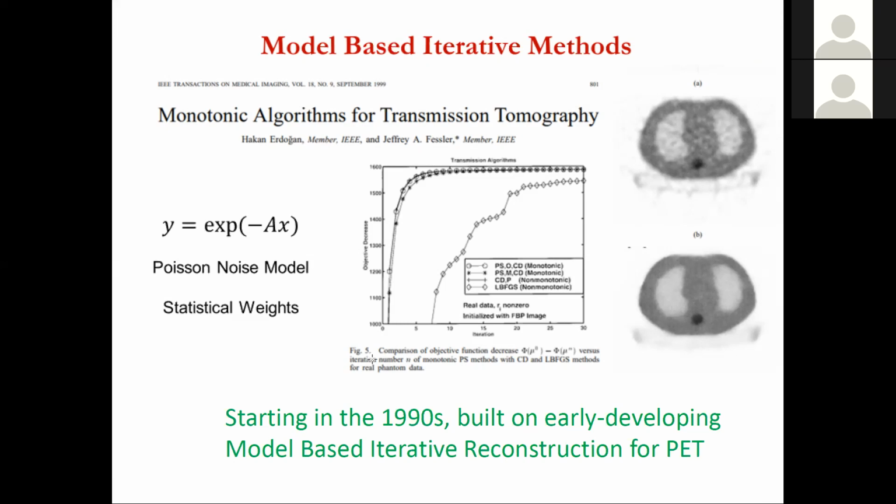You can add noise. You have statistical weights, and what it does is it cleans things up. Particularly, you also introduce a regularizer, and the regularizer basically introduces a Bayesian term. When you're doing a reconstruction, it's trying to find what source distribution would have the highest likelihood of producing precisely the data that you collected. So it can overtrain on that, right? Your Bayesian term says you want the distribution which is both likely to exist and to produce exactly the data you saw. So that prior knowledge term gets put into your regularizer, and you say, I don't want it to have the speckling. That's how you keep it from overconverging with the regularizer term.